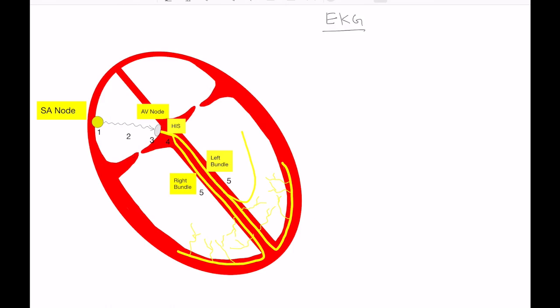So the first thing you're going to notice on a surface EKG is the isoelectric line. This is the period of non-conduction. There's no depolarization going on here. Nothing's firing. This is what you're going to see in between heartbeats. And the first thing that starts out the cardiac cycle is the firing of the sinoatrial node right here in number one. That's what's going to start our cardiac cycle in the EKG.